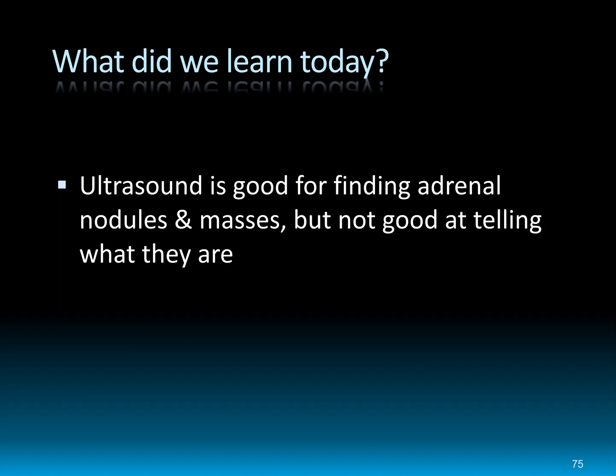As with a number of other organs, ultrasound is good for finding adrenal nodules, good for finding adrenal masses, even enlargement, but it's not the greatest at distinguishing what different masses are. Ultimately, you've got good sensitivity, but only moderate specificity for diseases.